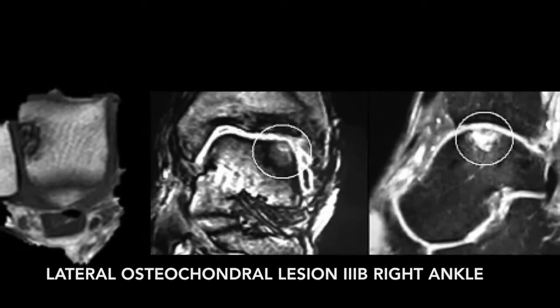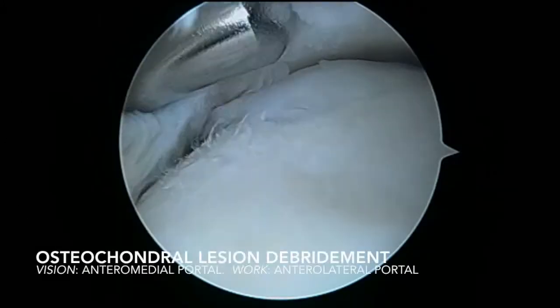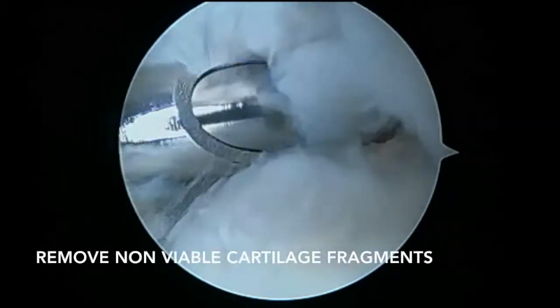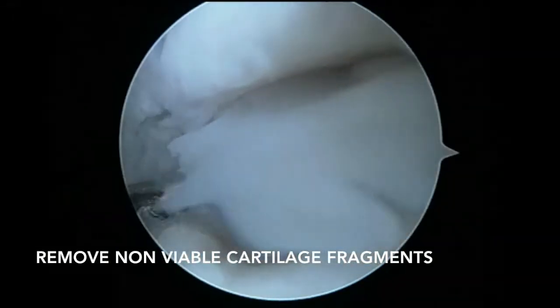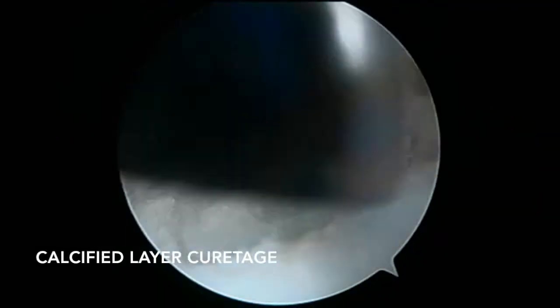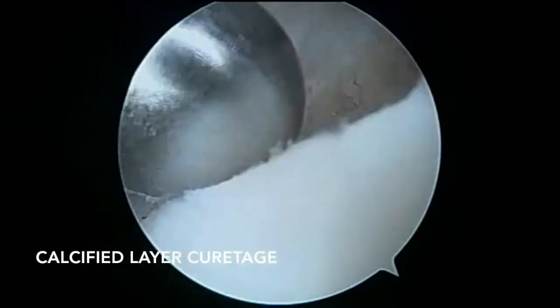We present the case of a 27-year-old man with a talolateral osteochondral defect, grade 3B, of the International Cartilage Research Society. We start with the debridement of the damaged cartilage and the removal of three non-viable fragments. After that, we proceed to curettage the calcified subchondral plate until we reach healthy subchondral bone.